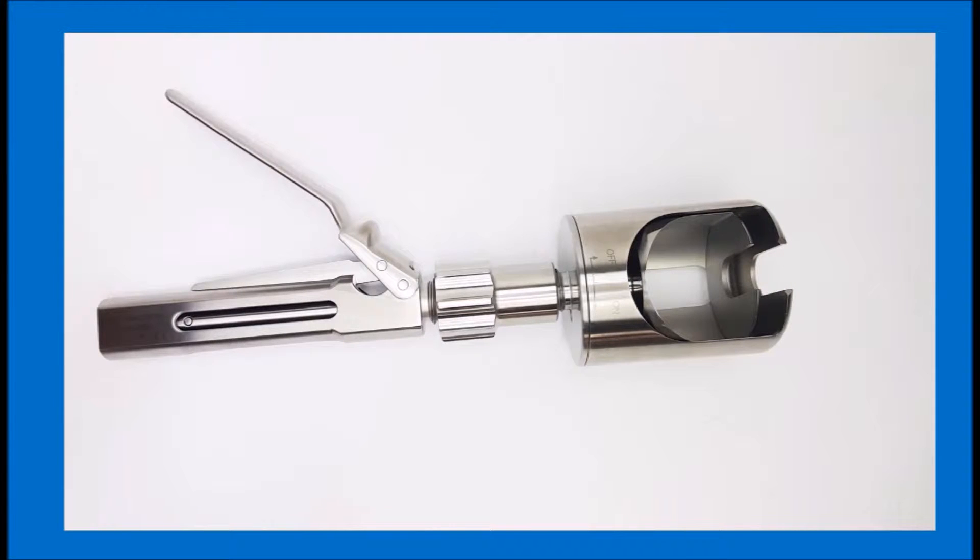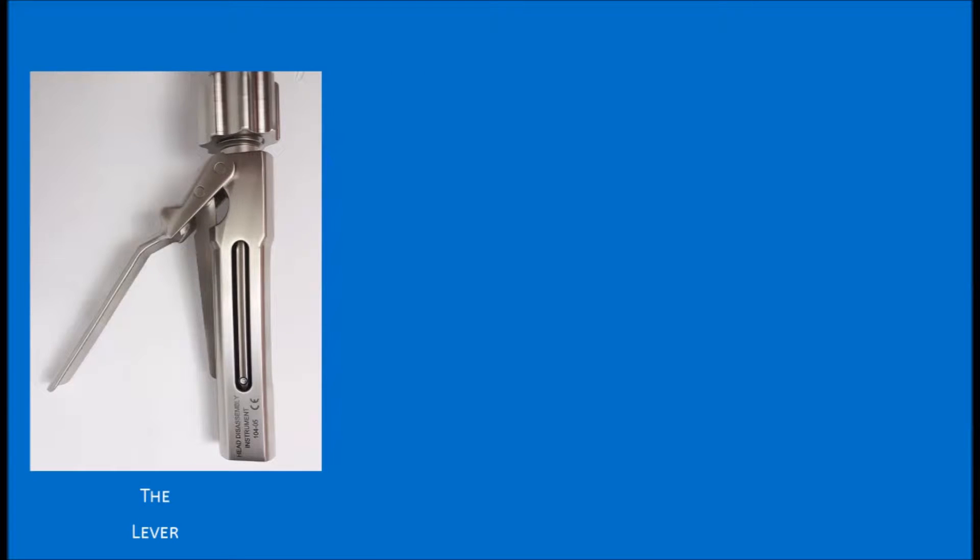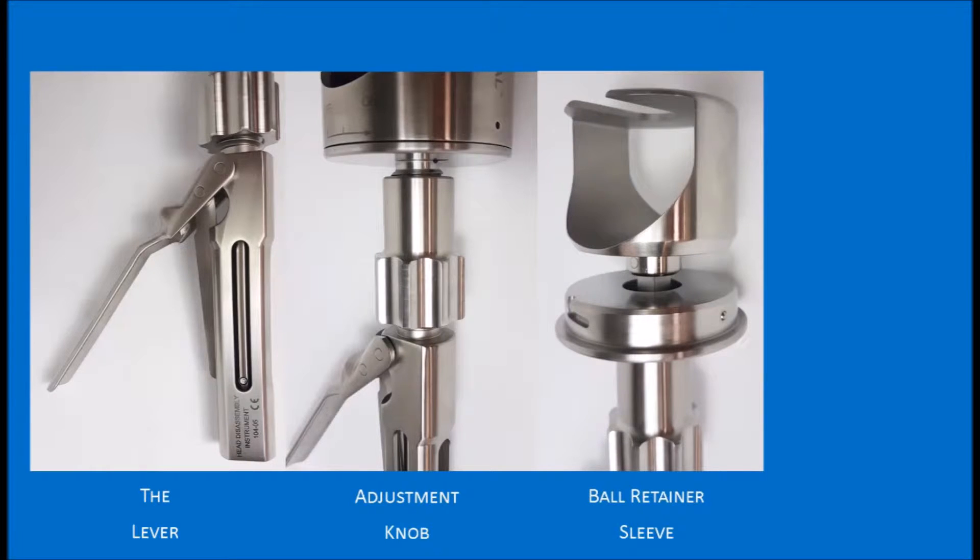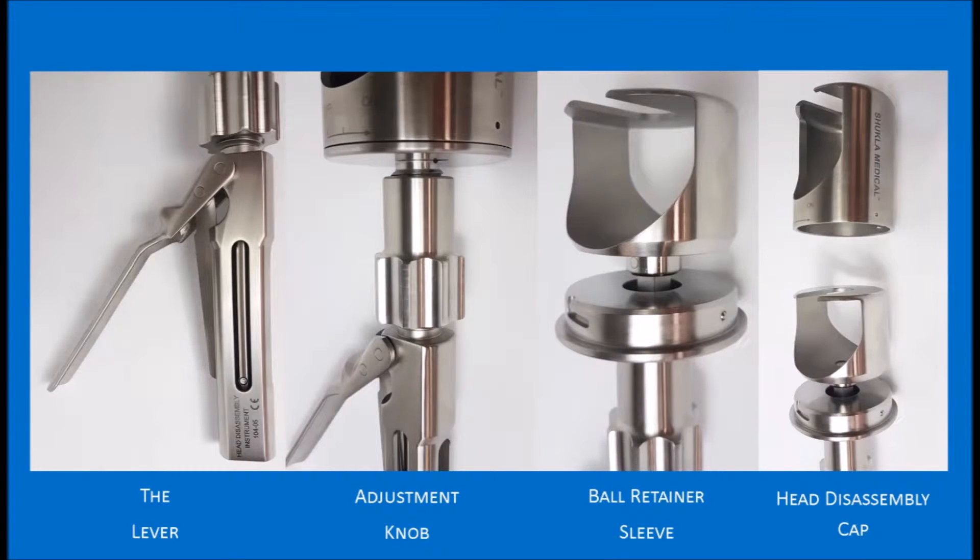We begin by naming its respective parts. The entire device is known as the femoral head disassembly instrument. This is the lever, the adjustment knob, the ball retainer sleeve, and the head disassembly cap.